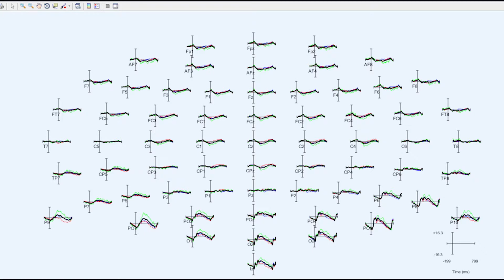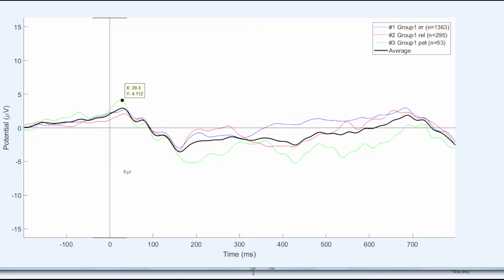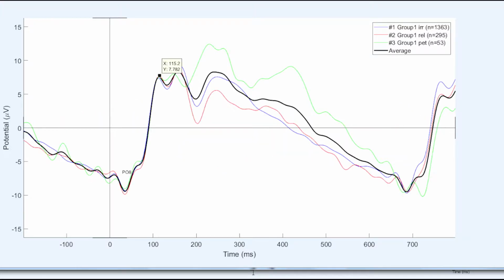Upon focusing on single subject ERPs, we were able to delve deeper into the components that were displayed in different channels, and therefore different areas of the brain. We found parietal occipital areas were most active closer to onset of stimuli, and central and frontal were least active. This is apparent in the channels C1 and FP1 in comparison to that of P08 and P04.